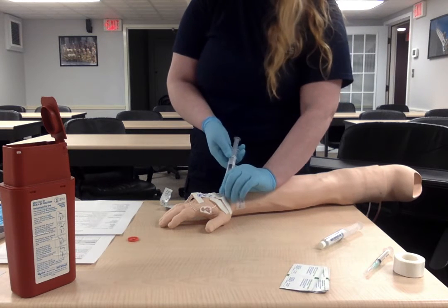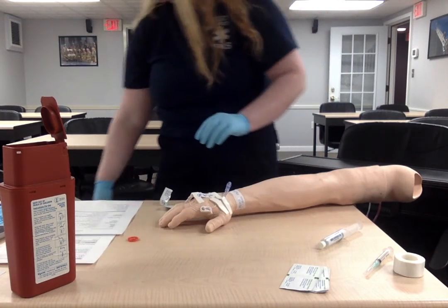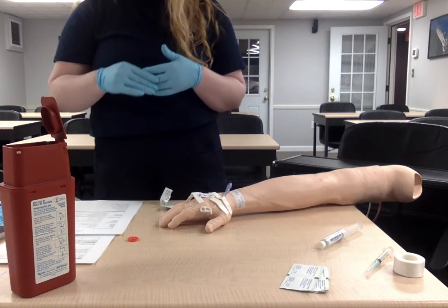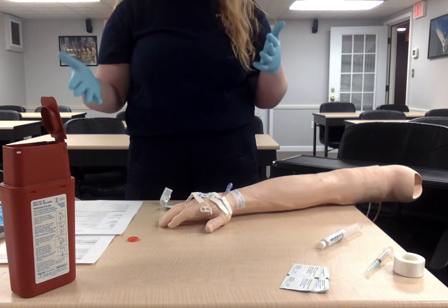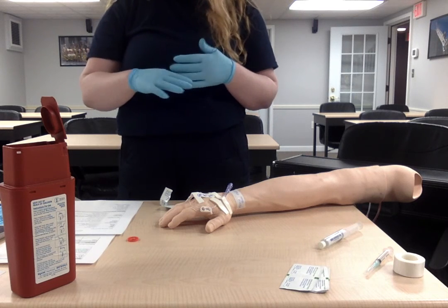Once we have that all set, we can discontinue this. We're going to clamp off. Dispose of your flush. We want to make sure that we clamp it off so that there's no backflow. We flush that to make sure, like I said, all the medications get in and make sure there's no occlusion of the IV. So now that it's clamped off, we've cleaned everything.